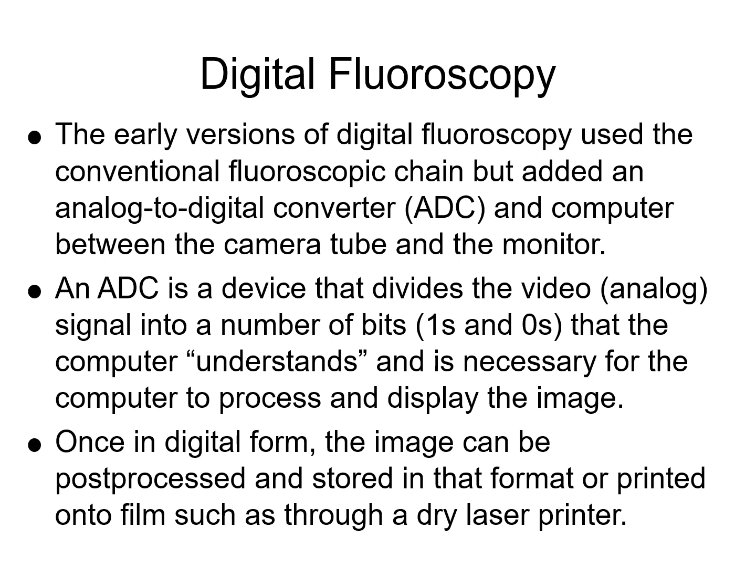An ADC is a device that divides the video, which is an analog signal, it's visible light, into a number of bits, that is strings of information. And what it really is doing is subdividing the picture into tiny little sections. Similar to what we learned in CT, it's dividing the picture into a matrix built out of picture elements, or pixels. Every digital imaging device does this. It breaks up a bigger macro image into very tiny images all mashed together. That is the essence of digital imaging.